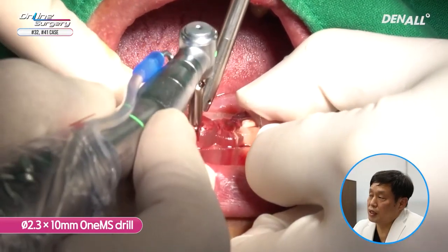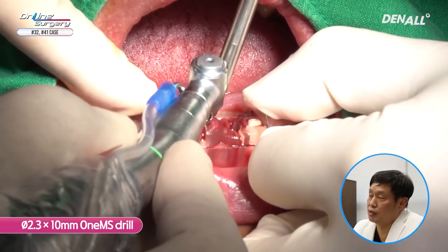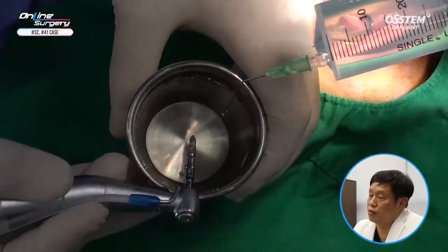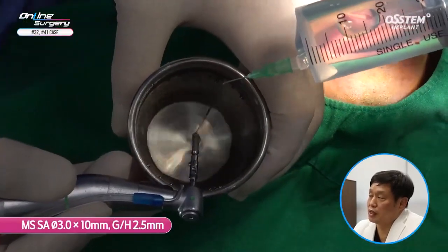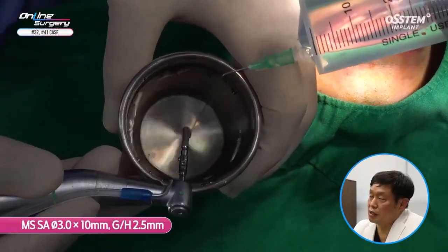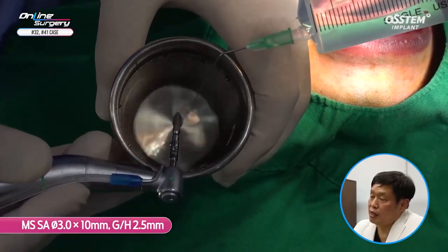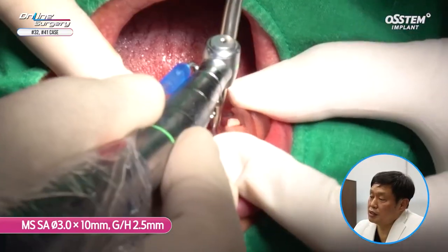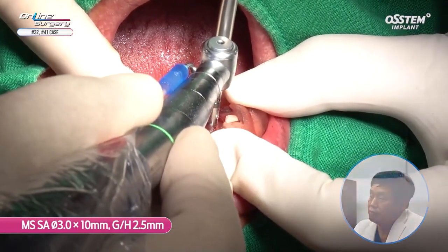When you use one MS, you need to use 8.5 first, regardless of the length of the final drill. You need to always pay attention to this. Now we are done. MS 3.0x10 mm, gingival height is 2.5.